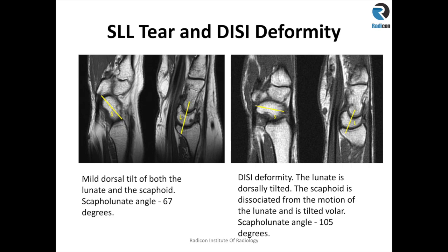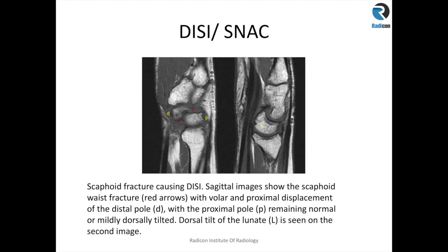We always look at the source or scout images to see how the wrist was scanned and then assess for DISI deformity. On the second image on the right, the scaphoid is tilted quite significantly. Measuring the angle along the long axis of the scaphoid and through the axis of the lunate gives a value well above 80 degrees — in this case 105 degrees — indicating DISI deformity.